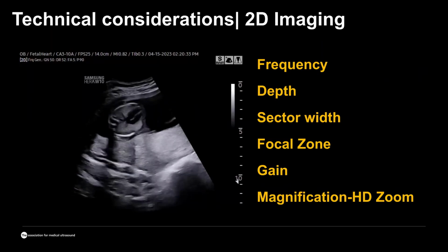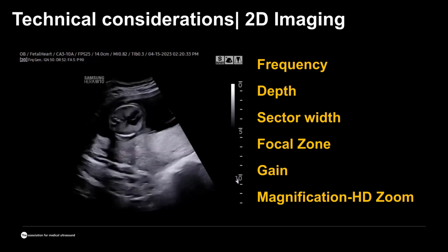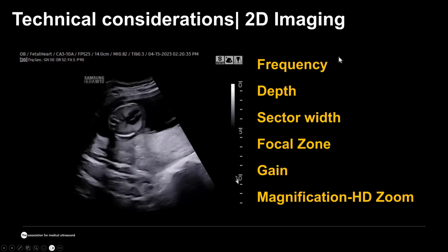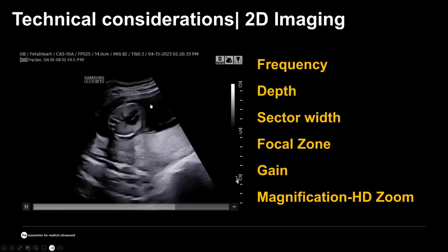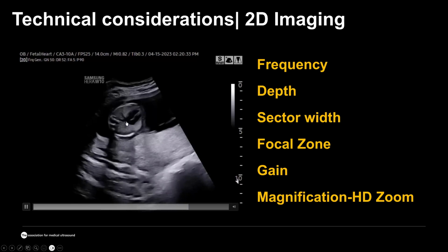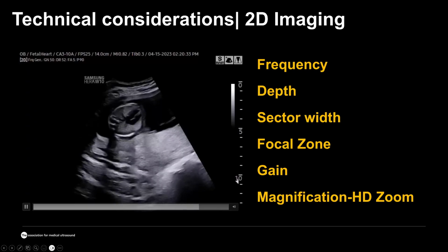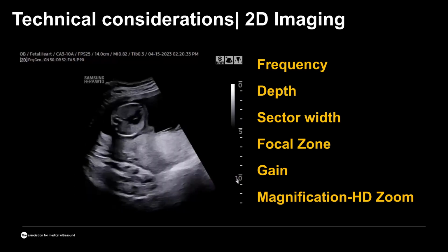Before we go into a lot of details, I would like to start from this image, because the technical component of cardiac imaging is very, very important for us. Even though on this image you can clearly see the cross-section of the fetal chest with the heart beating, it should not be used for clinical evaluation, because this image requires a lot of work to optimize to be acceptable for clinical judgment.